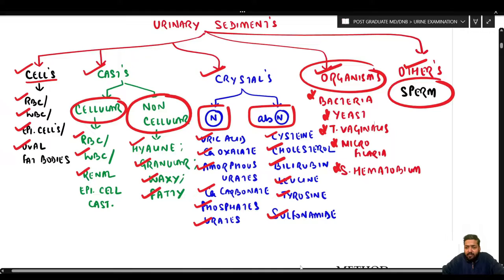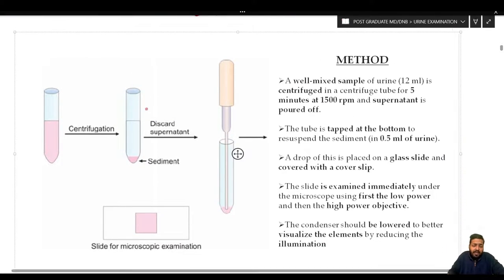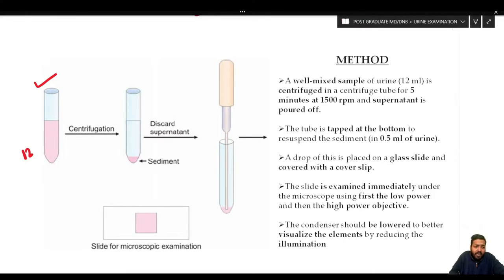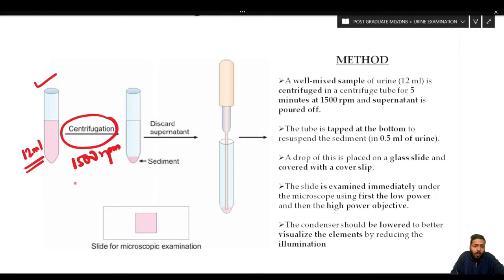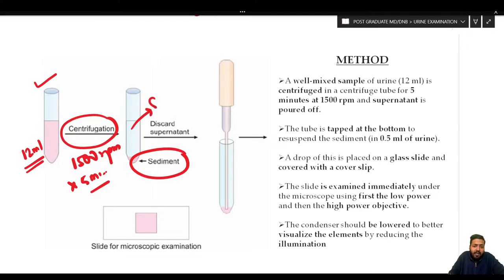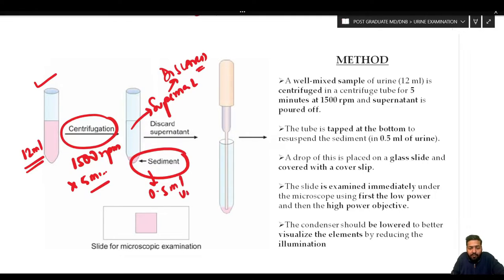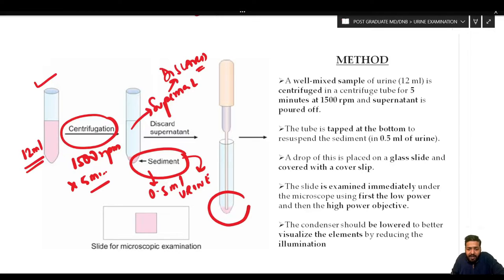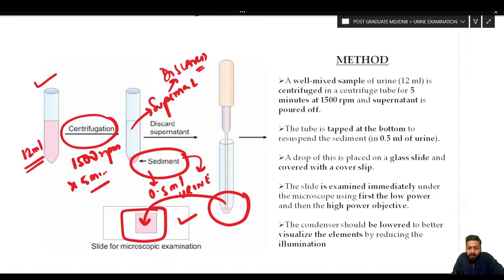To prepare a urinary sediment, take a well-mixed 12 ml urine sample in a test tube and centrifuge it at 1500 RPM for five minutes. After centrifugation, discard the supernatant, leaving behind only 0.5 ml of urine. Resuspend the sediment by tapping at the bottom of the test tube to get a resuspended urine sample.